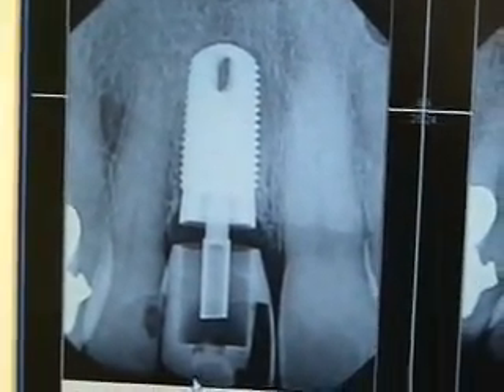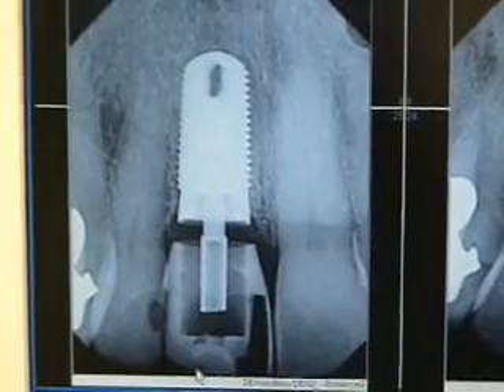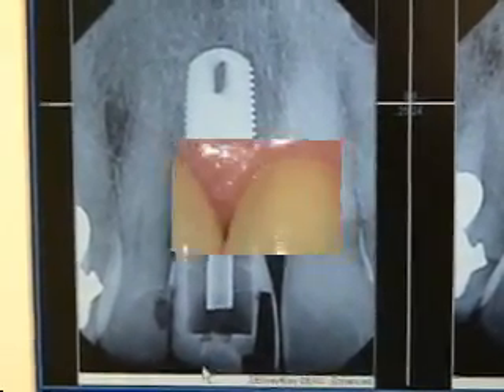Here's our immediate placement, and here's what our implant looks like today after two and a half months. We'll see the final restoration next.